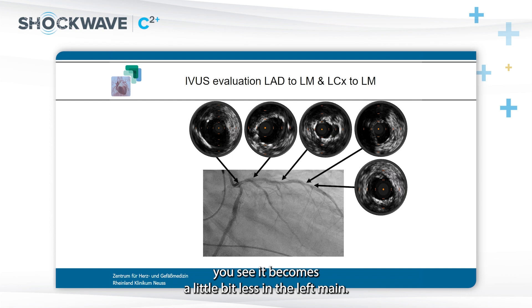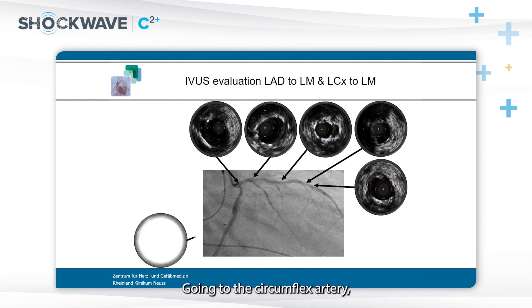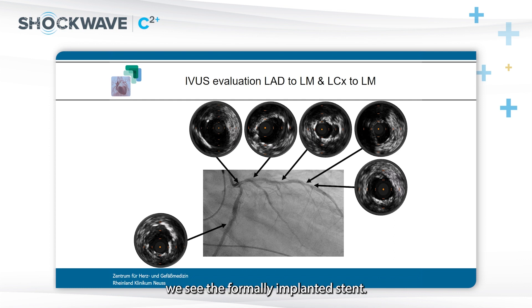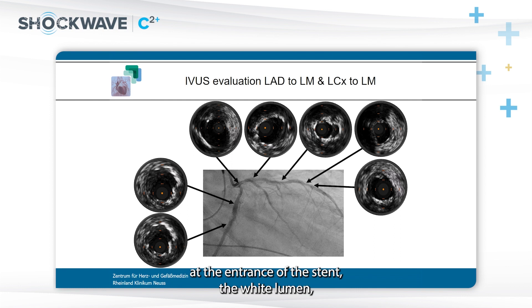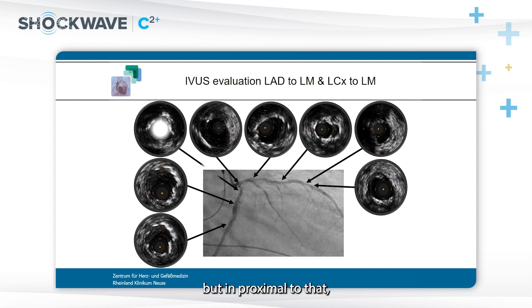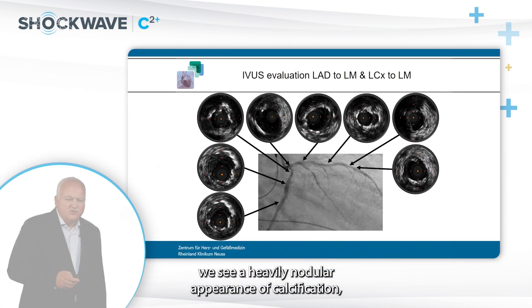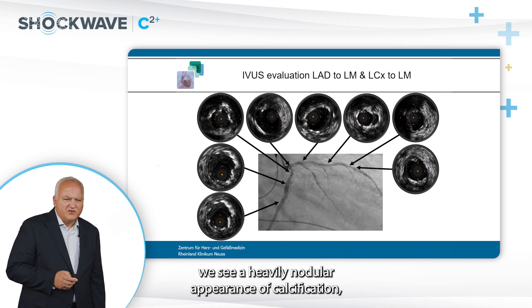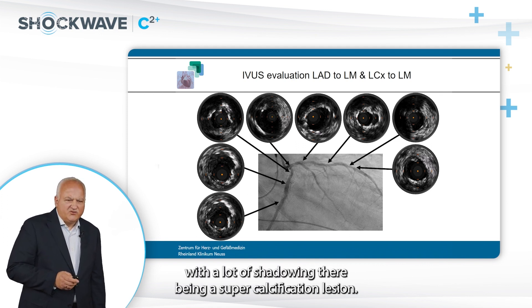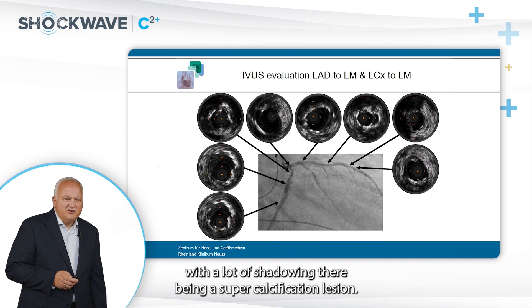Going very proximal, it becomes a little less in the left main. Moving to the circumflex artery, we see the formerly implanted stent, then proximally at the entrance of the stent a white lumen. But proximal to that, we see a heavily nodular appearance of calcification, more than 180 degrees, with a lot of shadowing — a supercalcified lesion.